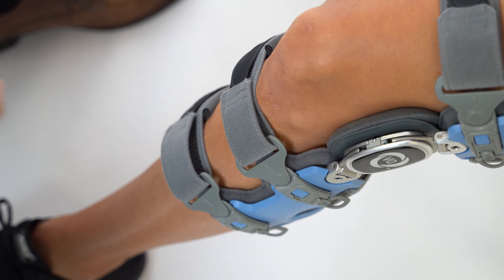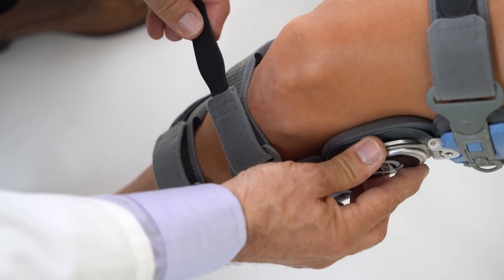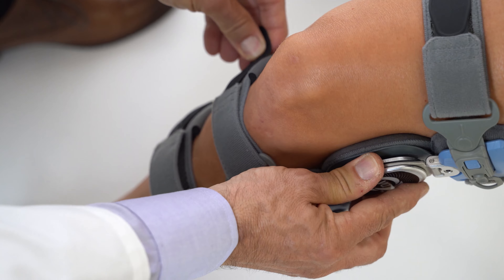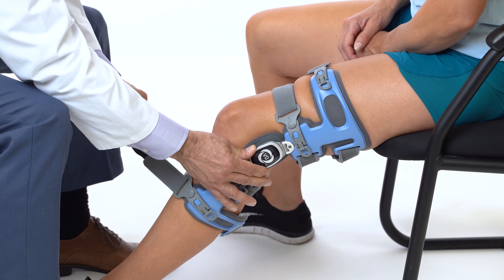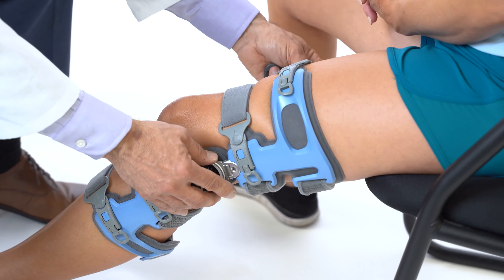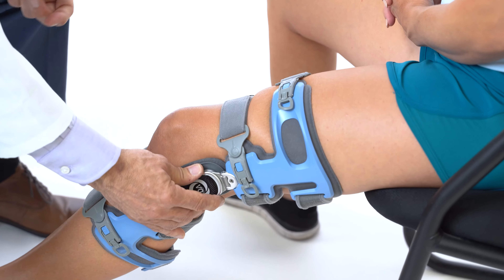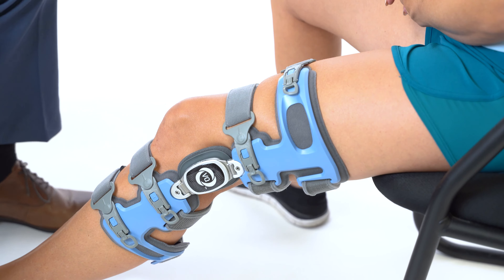Hold the brace at the hinge to prevent rotation and tighten the straps. Fasten strap one snugly above the calf muscle — strap one is important in maintaining brace position. Fasten strap two around the middle of the calf, strap three around the lower thigh, and strap four around the upper thigh. Straps should be comfortably tightened; do not over-tighten the thigh straps.